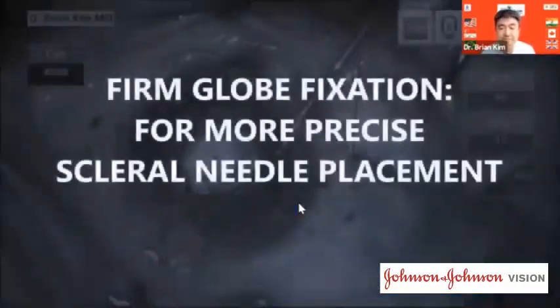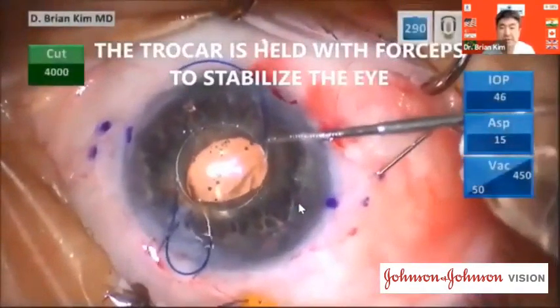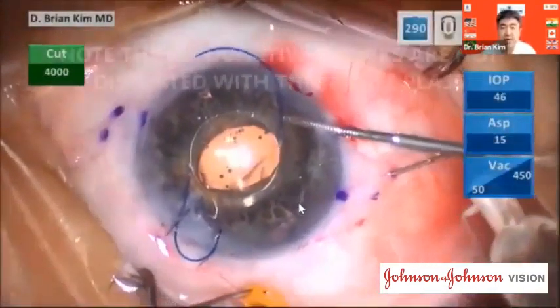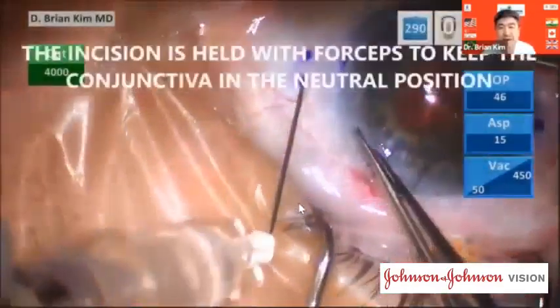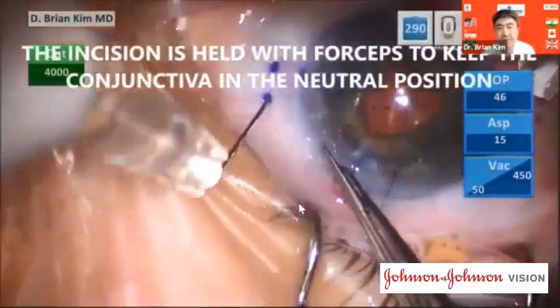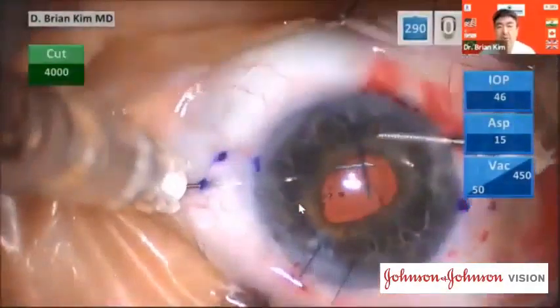And so I'm going to illustrate this with a video. The trocar is held with the forceps to stabilize. I want you to appreciate how neutral the conjunctiva is in this position. And so by maintaining the conjunctiva in the neutral position, you can more predictably place the scleral placement of the needles.